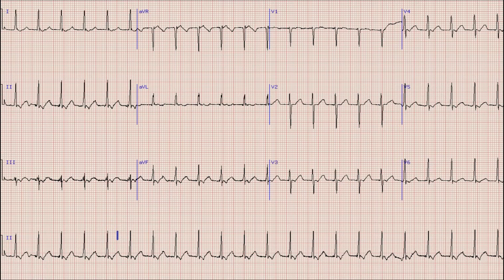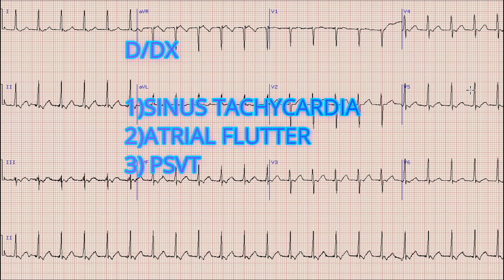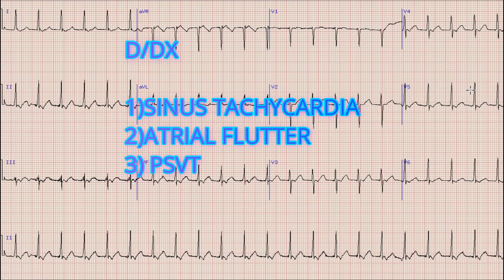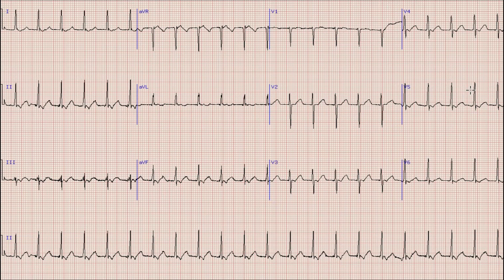The next question is: what are the differential diagnoses of a narrow complex regular tachycardia? Firstly, sinus tachycardia. Second, atrial flutter with fixed AV block. Third, paroxysmal supraventricular tachycardia. Our aim is to differentiate between these three entities.